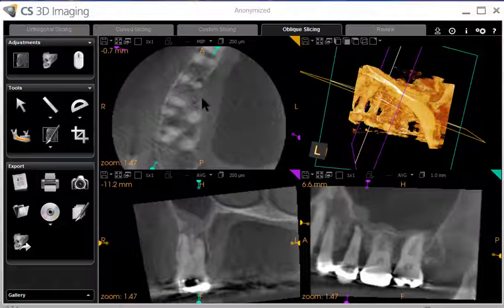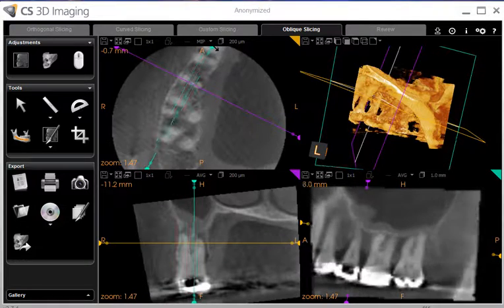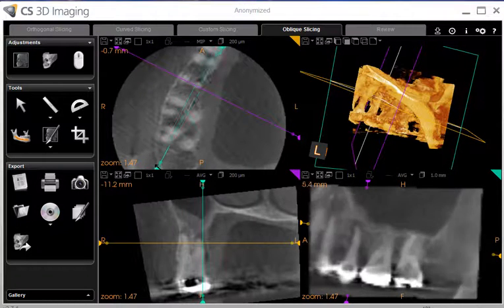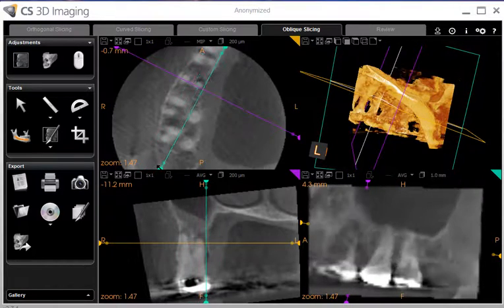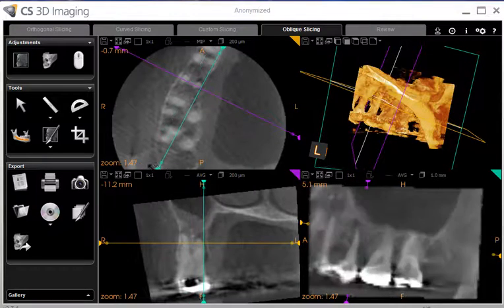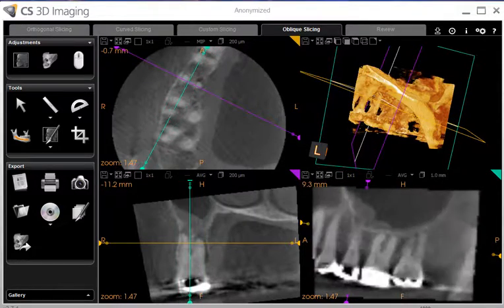I like to go to the oblique slicing. The oblique slice allows you to move the angle of the slice in all three dimensions. When you place the cursor over the colored semi-circle, it becomes a double arrow, and when you hold the left mouse button down and move the cursor back and forth, you can see in the lower right window — which is color coded green — that you are moving that slice.